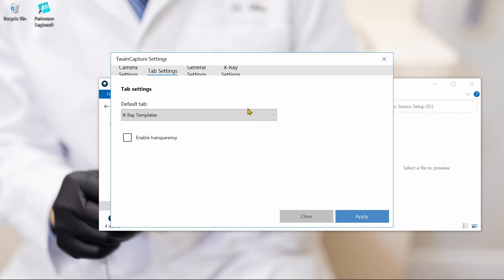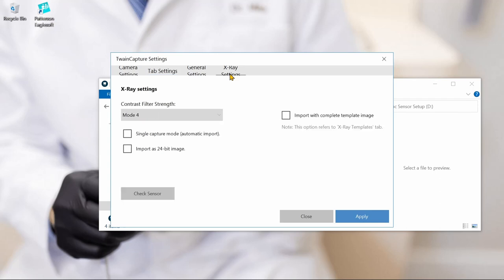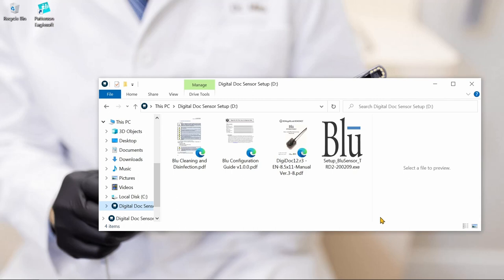Then, moving on to the X-Ray settings, we'll ensure that the box for Single Capture Mode and Import with Complete Template Image are both unchecked. Click Apply, and the driver is now ready to set up in EagleSoft.